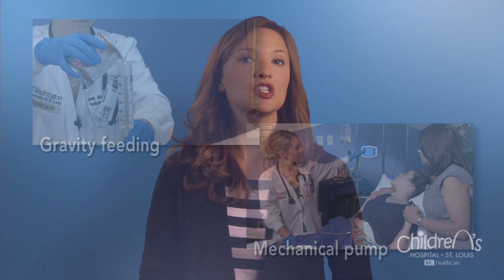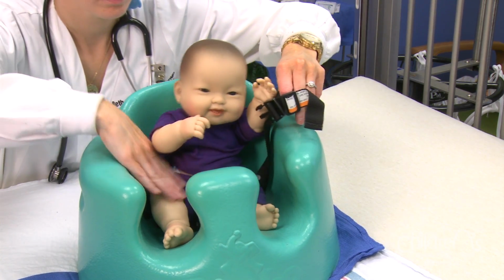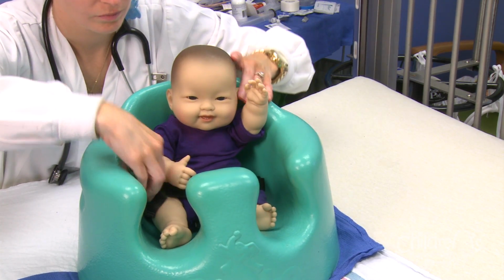If the feedings are given too fast, your child may feel cramps, including belly pain, retching, or vomiting. When giving feedings, remember to do it slowly. You may place your child in a safely secured infant seat, wheelchair, or chair during feedings. Your child may also lie on his or her right side if getting fed at night. This will help to empty the stomach.